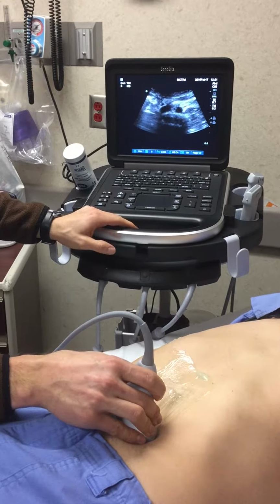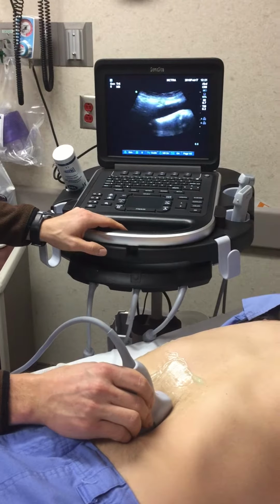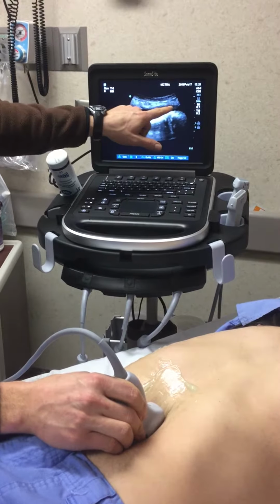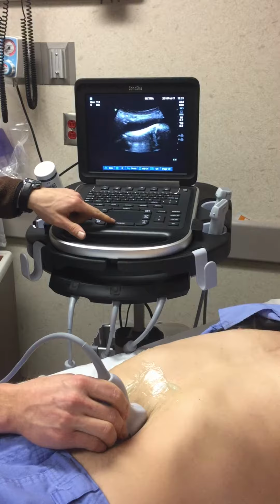And then lastly, you can do a nice sagittal view. So I usually turn my probe with the indicator towards his head in a nice sagittal longitudinal fashion. And you can see here the pulsatile aorta in long view. You also can freeze and measure that with your calipers.